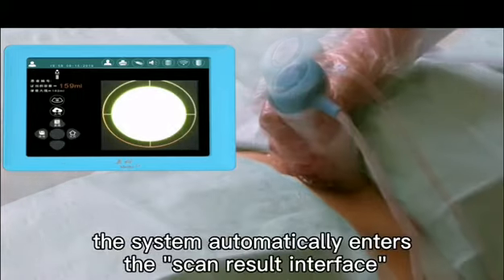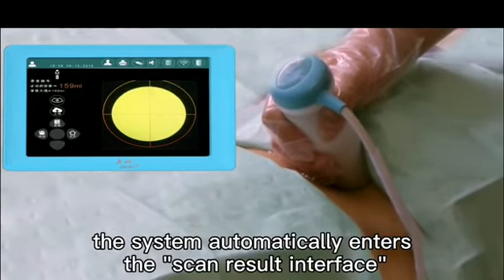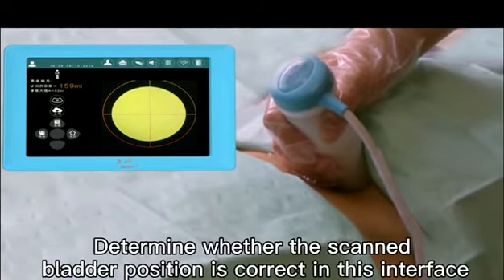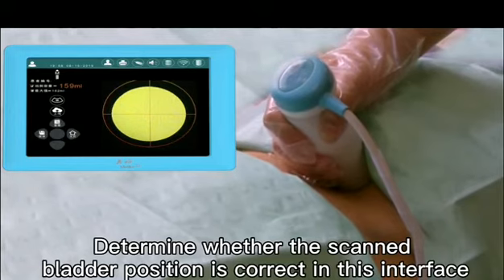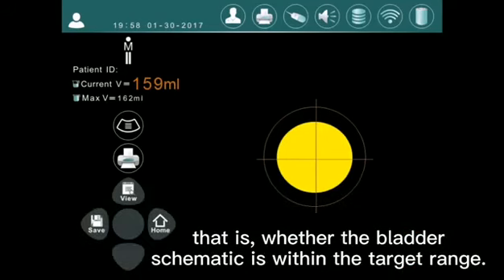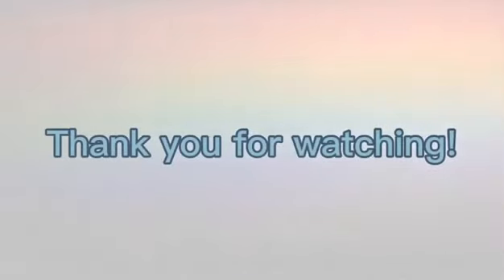After the scan is completed, the system automatically enters the scan result interface. Determine whether the scanned bladder position is correct — that is, whether the bladder schematic is within the target range.